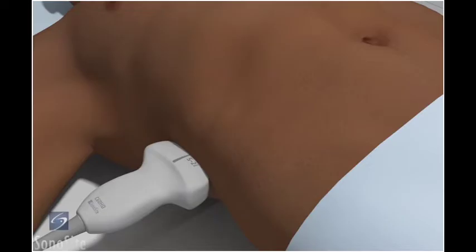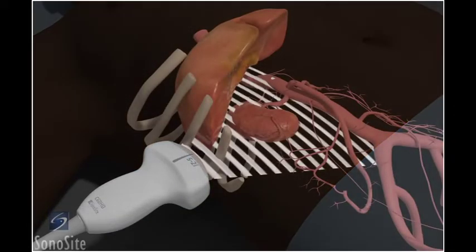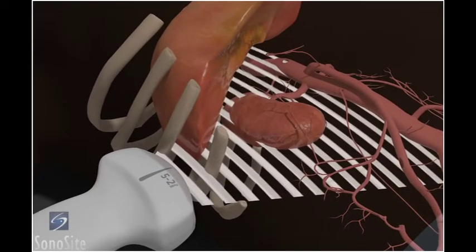It may also be necessary to move the transducer proximally along the mid-axillary line to visualize the kidneys using an intercostal approach. Using this approach will result in rib shadow artifacts overlying the ultrasound image.